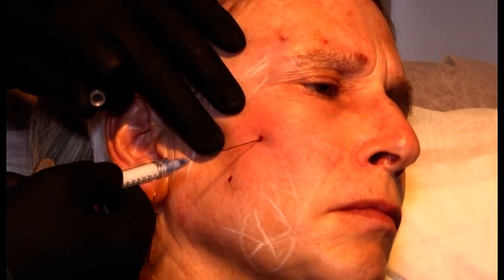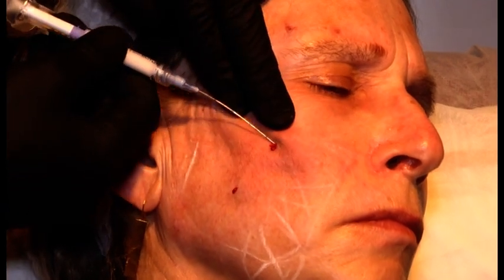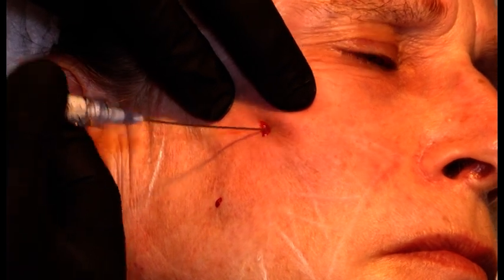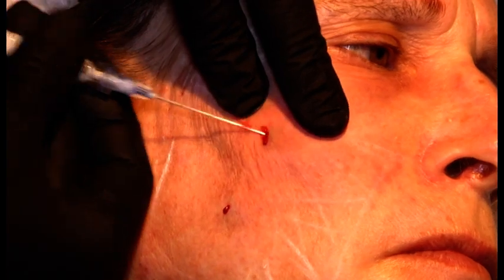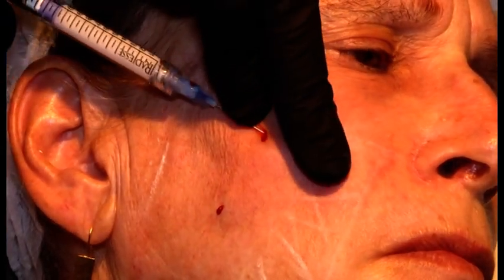Okay. So I had 0.5 injected, and I'm continuing the treatment from here. Retrograde linear threads.